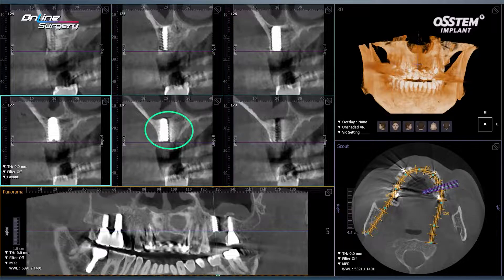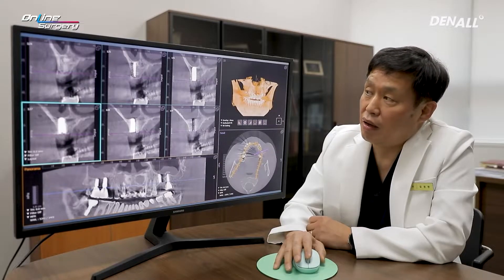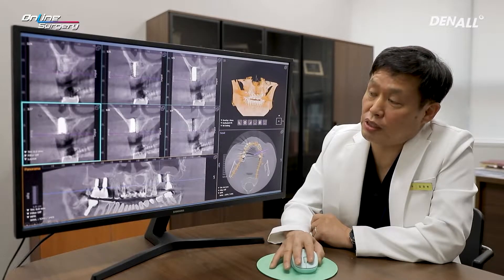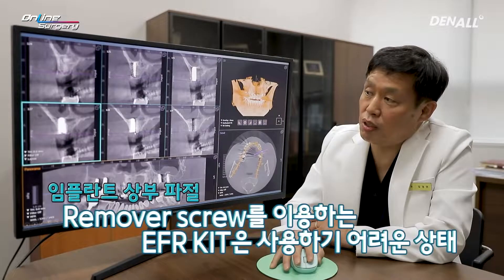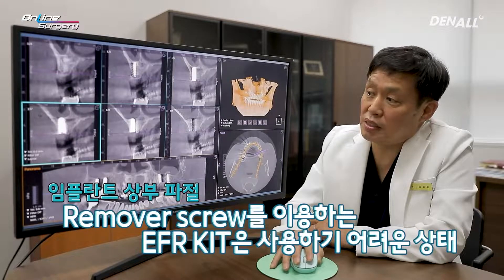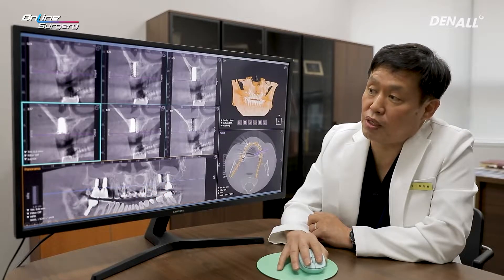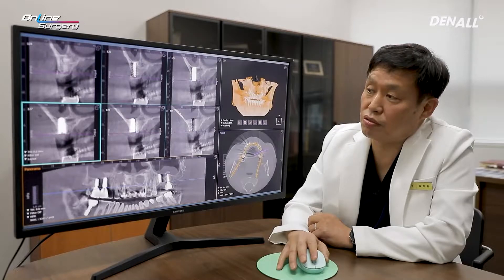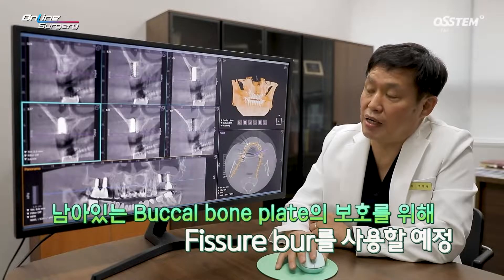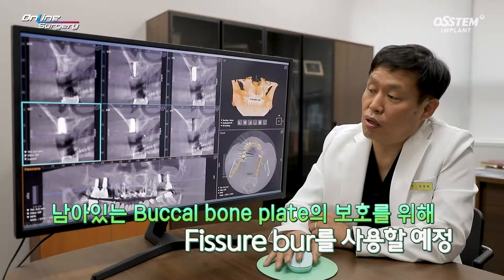I plan to remove the implant and place a new one. When the implant is fully osseointegrated and the superstructure is fully fractured, it is difficult to use an EFR kit. If you use a Trephine Burr, the buccal plate will be destroyed. Therefore, in order to preserve it, I use a Fissure Burr at high speed to make a slight gap, gain fulcrum, and use an elevator to luxate the implant for removal.